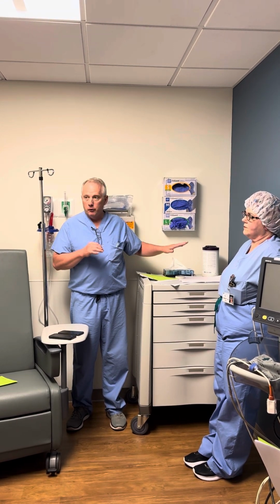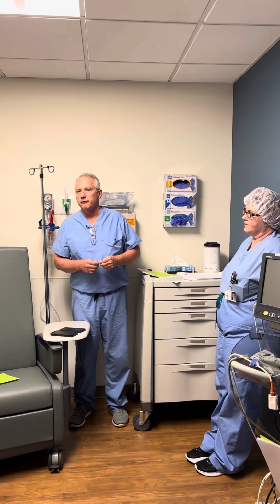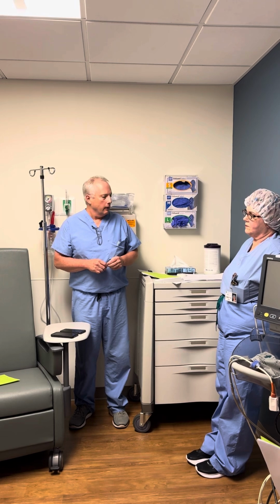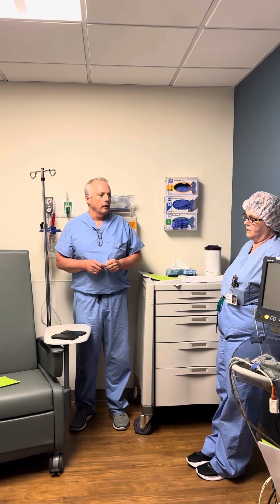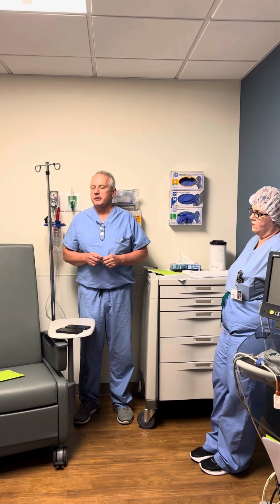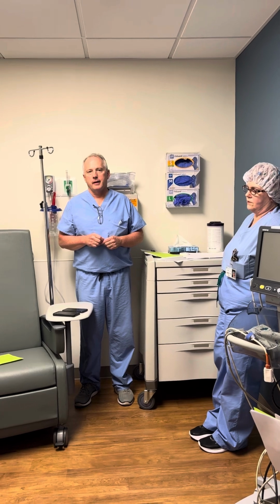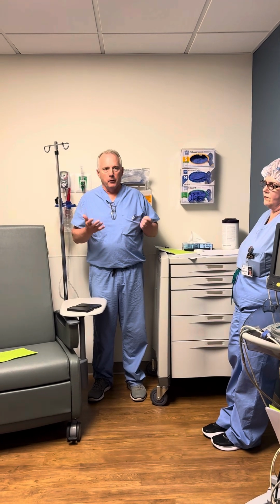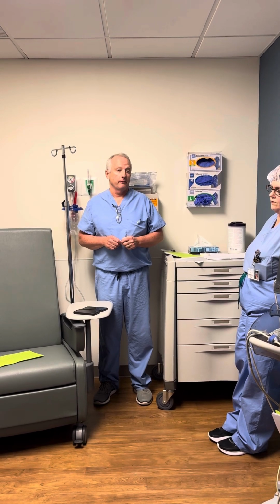And again, you have your specific institutional policy here. It could be different elsewhere, but overall, this is actually very close to what we see just about everywhere. But there are always those instances where it becomes a panic situation. In that case, when in doubt, putting a magnet on a device, there's really no downside to that.